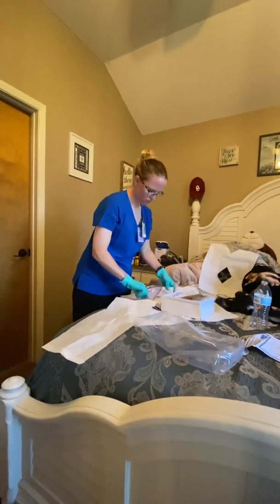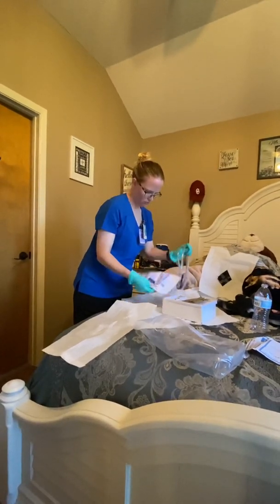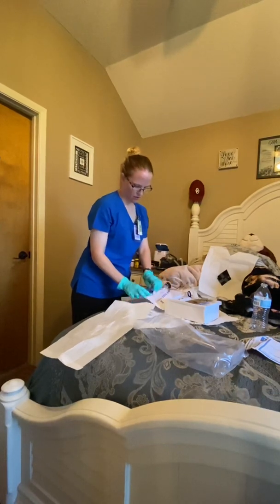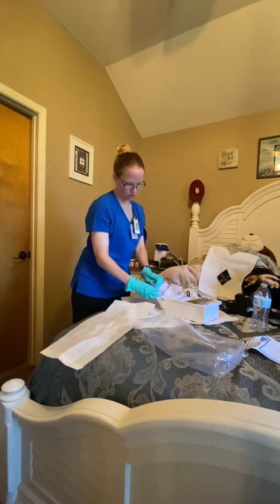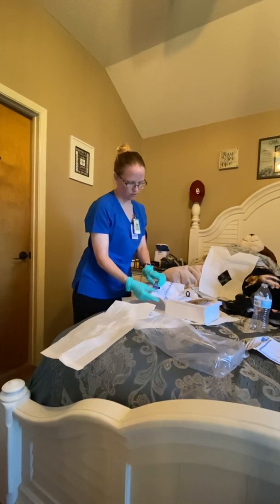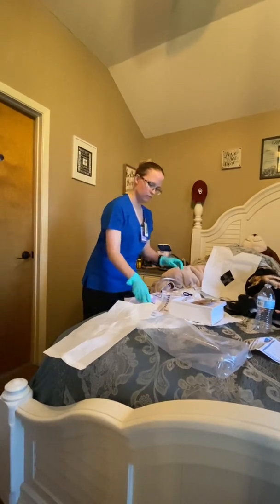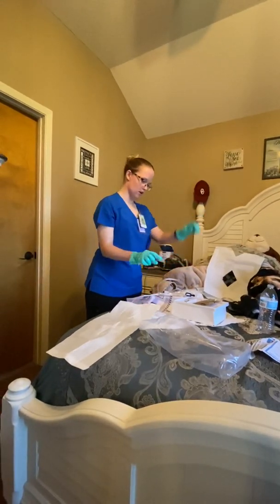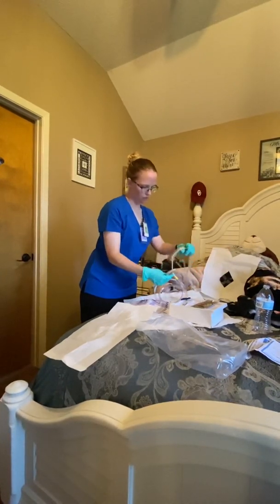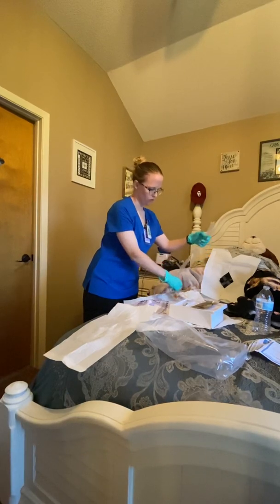Now, we'll make sure that this clamp is in the lock position. So here's an unlocked one. We're going to clamp it in the lock position. This is so urine doesn't come out whenever the urine is passing through the catheter tube. We're going to place our syringe. Actually, what we're going to do first, we're going to take this off. Make sure to keep it in the sterile field, of course.